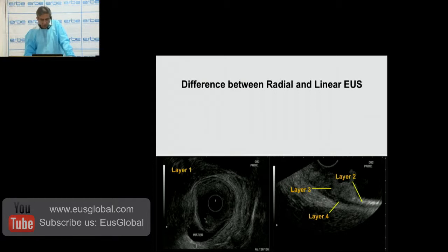The radial endoscopic ultrasound scope is there. The thing is, today I don't use a radial endoscopic ultrasound at all. Even for the rectum, I use only linear endoscopic ultrasound because I am comfortable and I like good quality, high zoom images, and I believe that the same number of crystals fitted in a radial ultrasound are fitted in a linear ultrasound, and they give very good quality images.